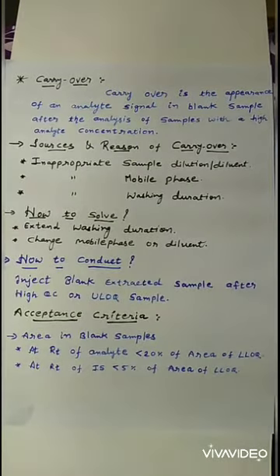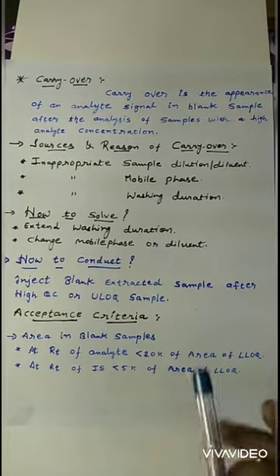So this is all about the carryover experiment, selectivity and specificity experiment.